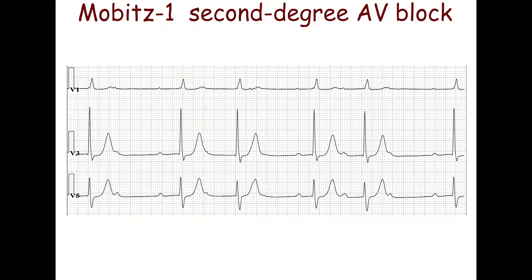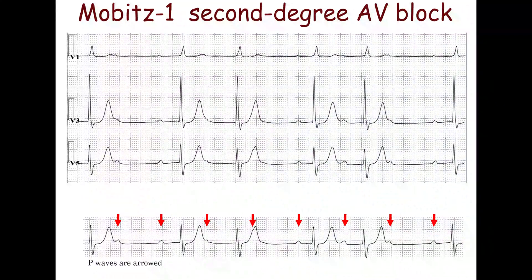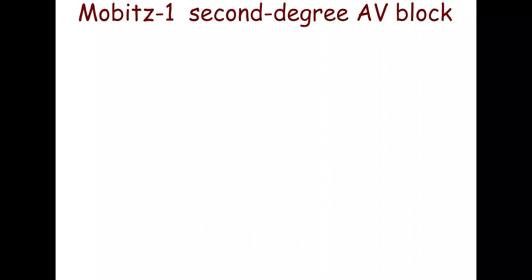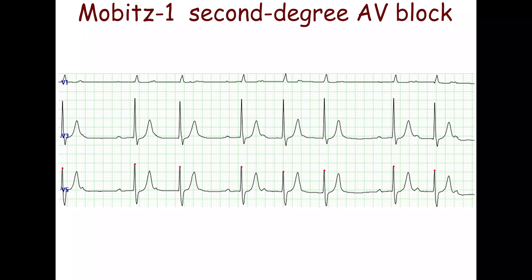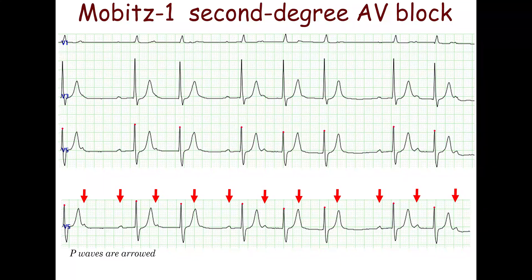Sometimes a constant, repeating conduction ratio is seen in Mobitz 1. On this ECG, there is a constant conduction ratio of 3 to 2. Sometimes the P waves may completely merge with the T waves, making them difficult to find. The PR interval after a non-conducted P wave is shorter than before it, which indicates Mobitz 1 second-degree atrioventricular block.